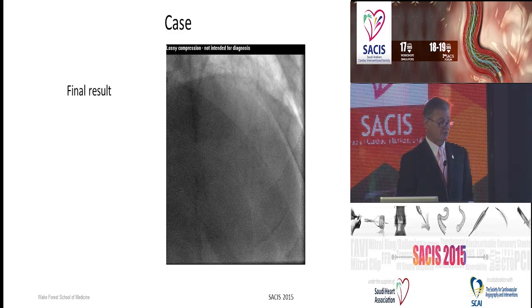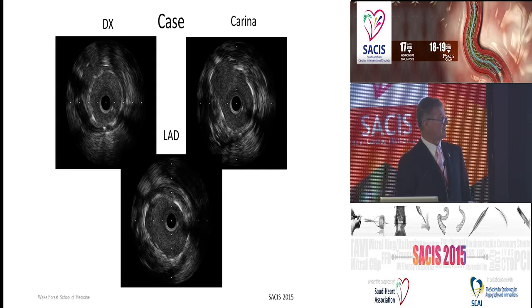I thought these were kind of interesting because part of the clinical trial we had to do intracoronary ultrasound at various steps here, and I think the one image that's perhaps compelling is the upper right, where we look at the carina, and we can see, as opposed to perhaps a provisional side branch stenting, we have a very nice large area that easily could be re-engaged if needed in the event that a future problem arises, such as restenosis.